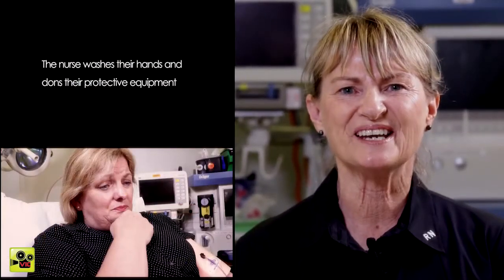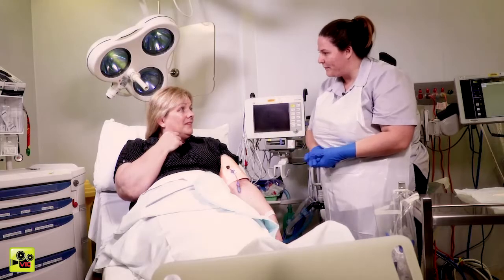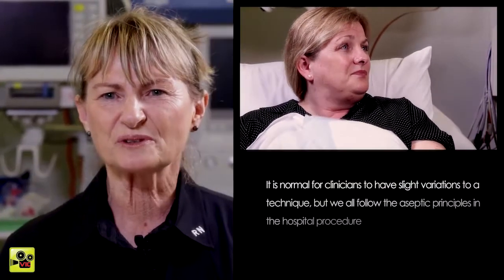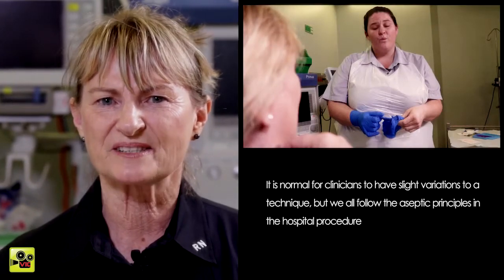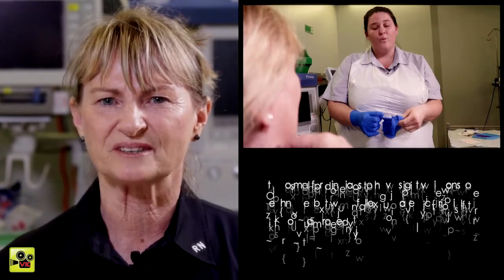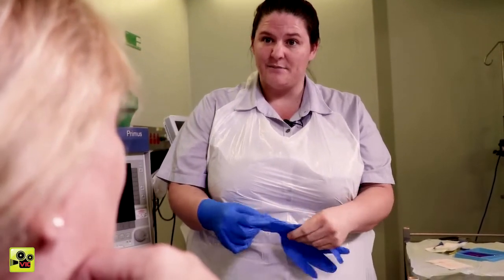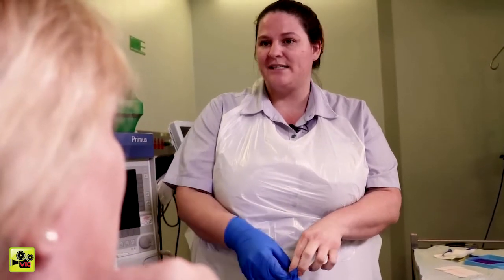The nurse washes their hands and dons their protective equipment. I'm just putting my gloves on now, Vic. How long have you had the PICC line for? Oh, 3 weeks, yeah. And I've noticed everyone does it a bit differently. It is normal for clinicians to have slight variations to a technique, but we all follow the aseptic principles in the hospital procedure. You will notice that there are some differences in procedures, but then there are a lot of similarities. So we all use the gloves, the chlorhexidine solution, the sterile pack. Okay, that's good to know that all differences are different, but it's all good for me.